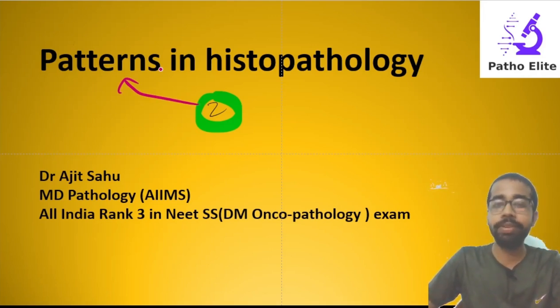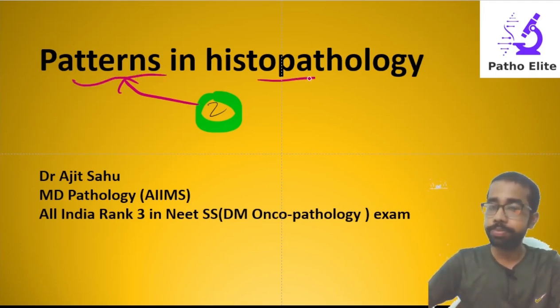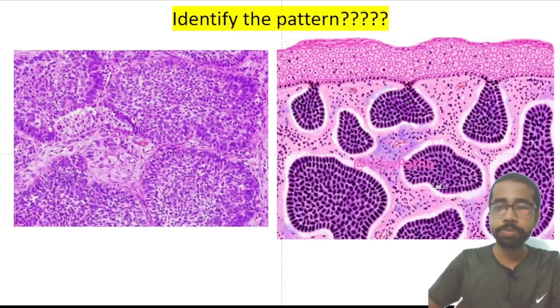So I thought I will make a small video. It's kind of a game only, kind of a quiz to learn the patterns in histopathology, right? So shall we begin? Just a small video only. Identify the pattern. I won't say I want the diagnosis. I don't want the diagnosis. Any pattern. What is the pattern? I have shown you this picture and I want this pattern. Right? What is this pattern?